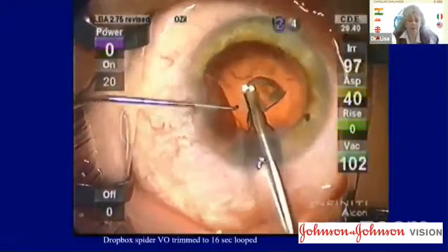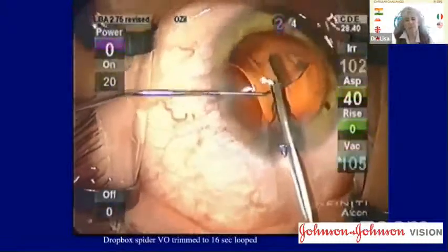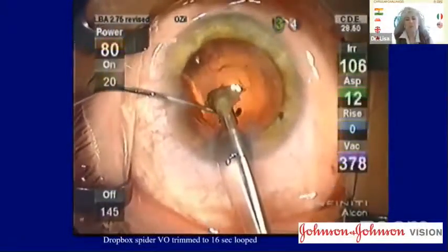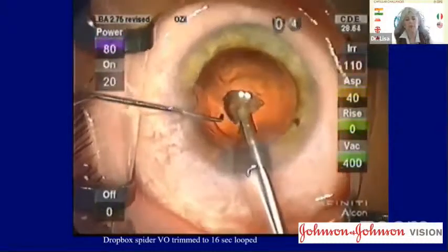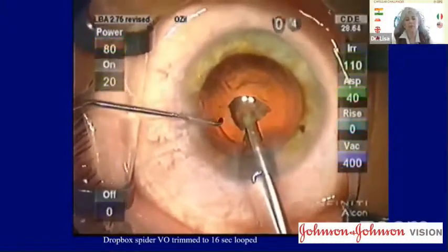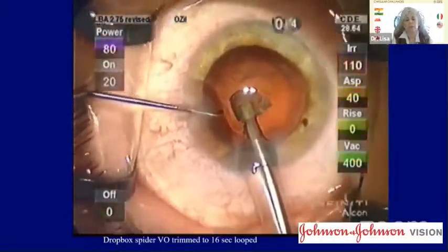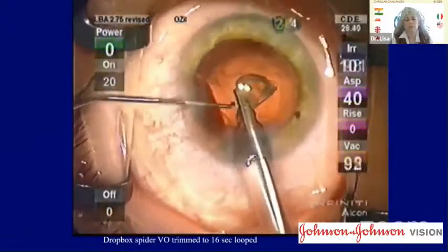Don't blink or you'll miss subtle signs. You'll see in a moment the spidering of the back capsule, despite protecting that capsule, for the last fragment right there. And that tells us that the likelihood is we've ruptured our capsule. We need to not withdraw our phaco instrument, but exchange the chopper. Don't blink or you'll miss subtle signs.